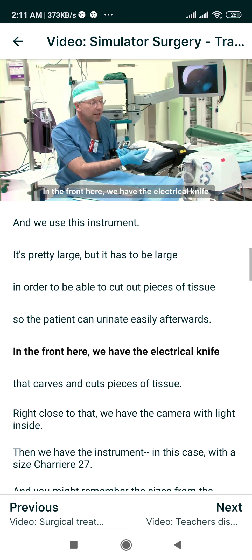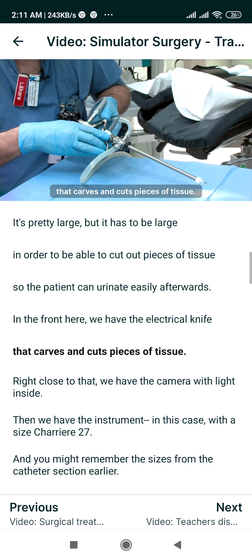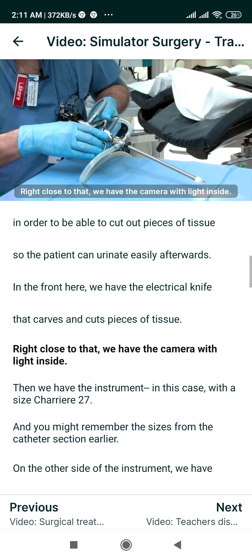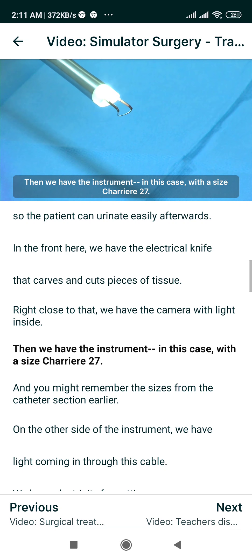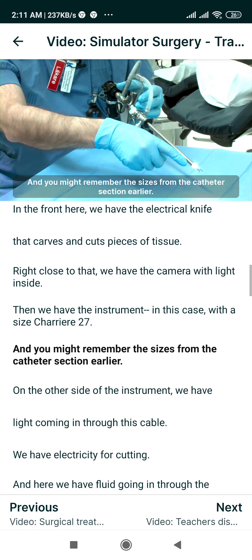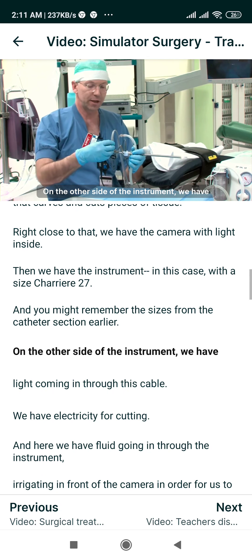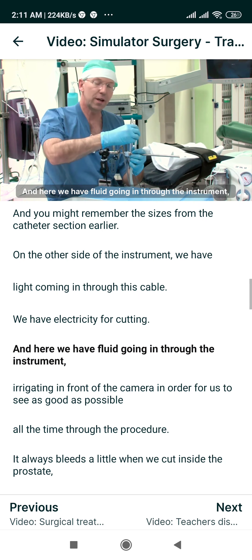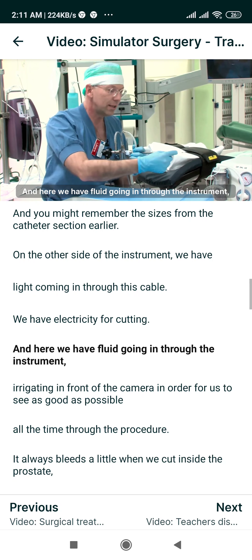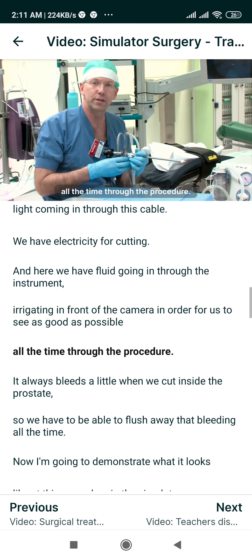In the front here we have the electrical knife that carves and cuts pieces of tissue. Right close to that we have the camera with light inside. The instrument in this case has the size Charrière 27, and you might remember the sizes from the catheter section earlier. On the other side of the instrument we have light coming in through this cable, electricity for cutting, and here we have fluid going in through the instrument, irrigating in front of the camera in order for us to see as clearly as possible throughout the procedure.